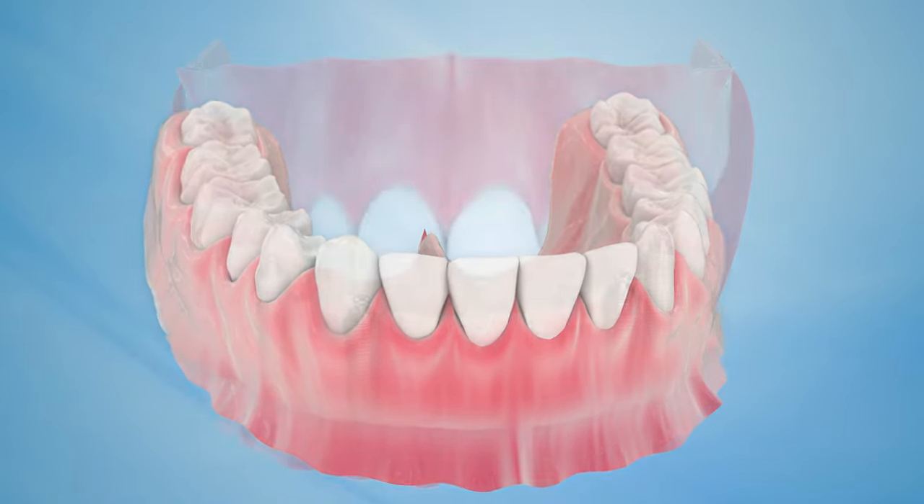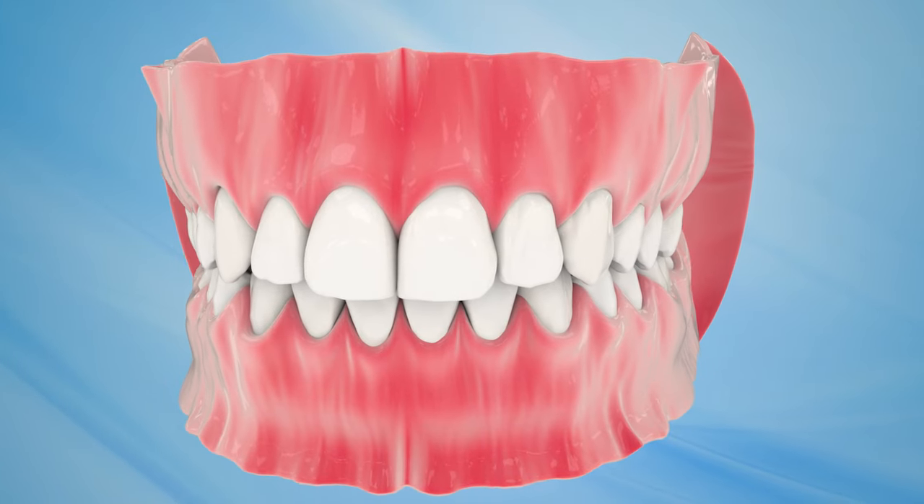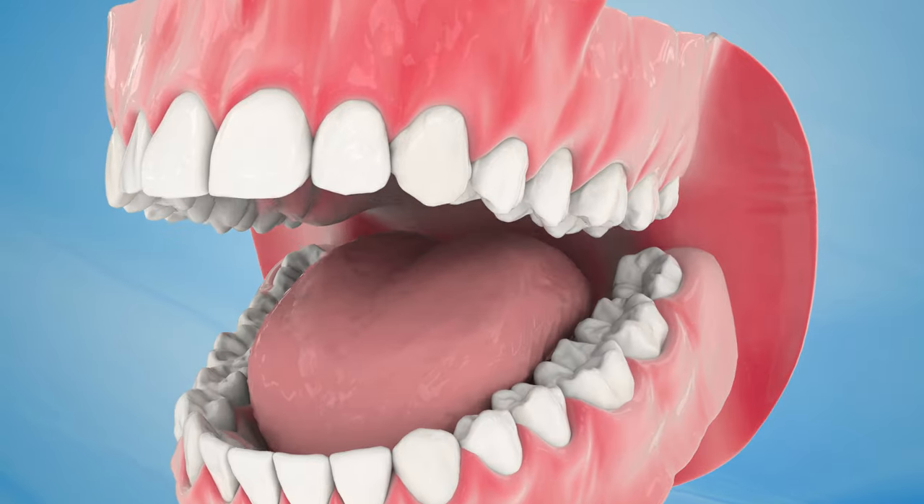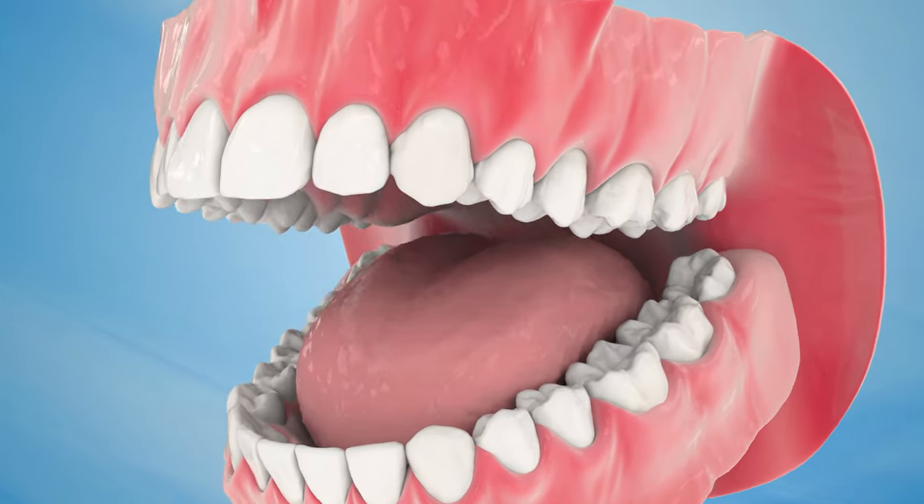Implants are designed to naturally blend with your teeth, allowing you to confidently smile, chew and speak, while also protecting the natural tooth structure of your remaining teeth.